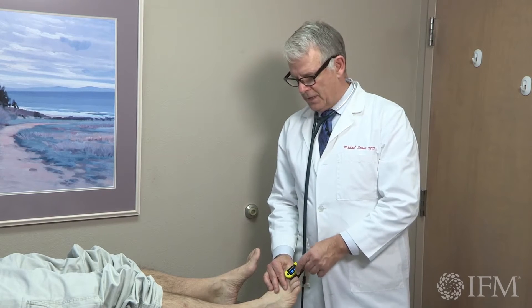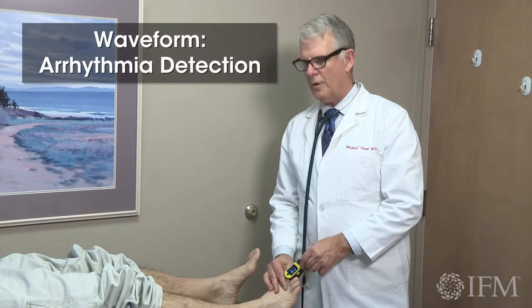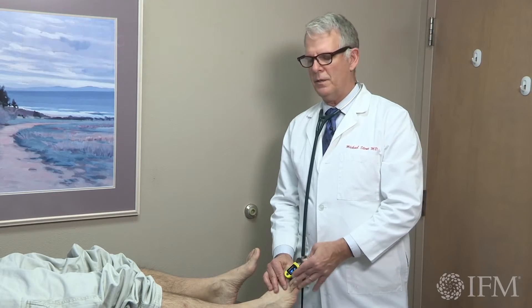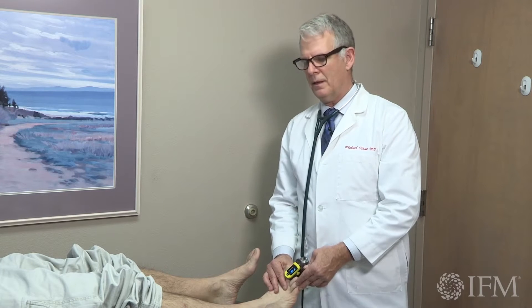Notice that you can get oxygen saturation monitors that have waveform, and you can pick up arrhythmia. Picking up an arrhythmia in the lower extremity is often the entry point for beginning to understand the arrhythmia that they're having at either upper or lower chambers in the heart.